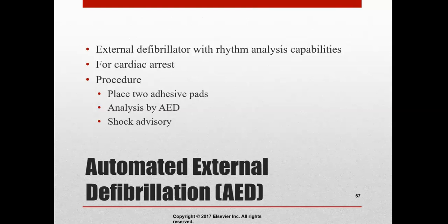And even the ones in the hospital, the Zolls, when you're doing compressions, it'll tell you if your compressions are deep enough, if they're not deep enough, or if you're doing really good. It'll say good compressions, and that is the weirdest thing to hear in the middle of a code. Good compressions, keep going. Compressions are too shallow, or compressions are too deep. Slow down. Compressions need to speed up. It literally tells you exactly what you need to know. It's the weirdest thing when you hear it the first time in the middle of a code, because you're like, who is saying that? And then you realize it's the AED.